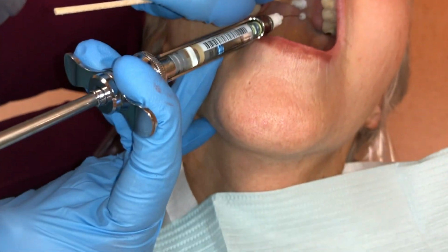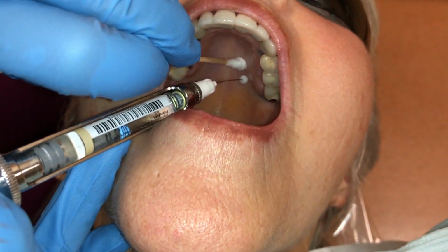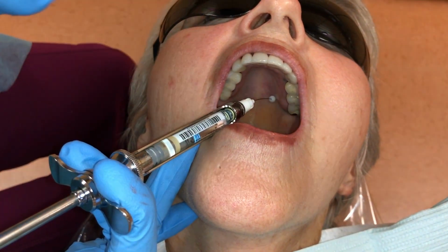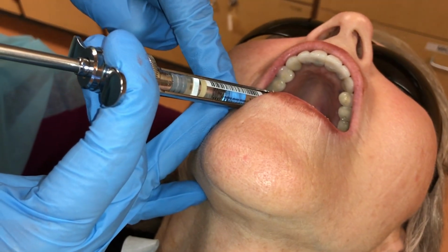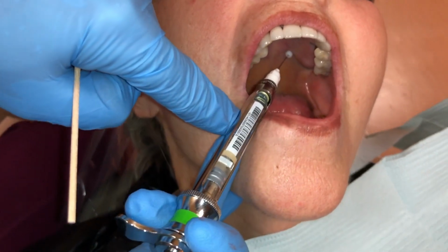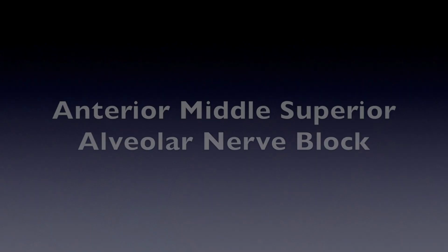You will also note that this injection takes 3 minutes if a 2% solution is used, or 1.5 minutes if a 4% solution is used. Some stability options are demonstrated, including the chin, or, once blanching is observed, flipping the Q-tip and supporting the syringe with a non-dominant hand. A wide area of blanching will be seen during the deposition of this injection.